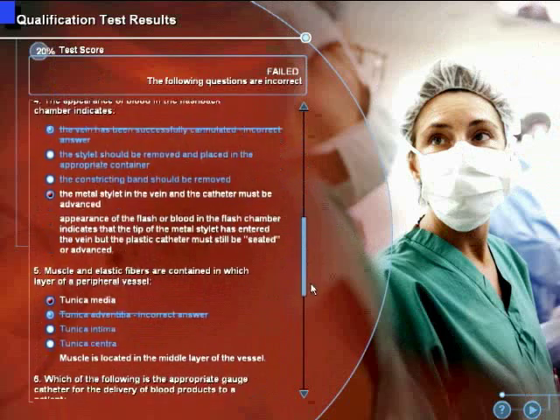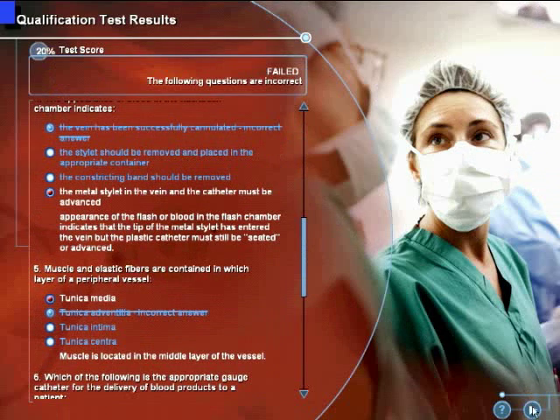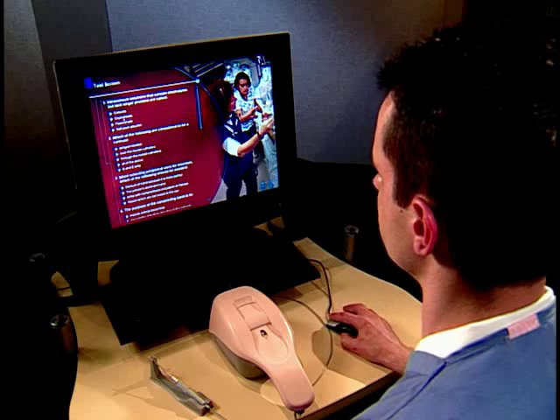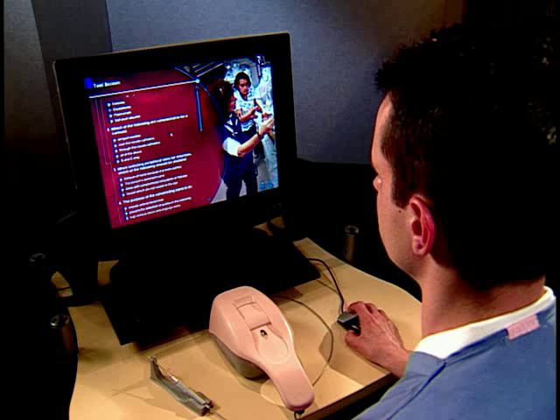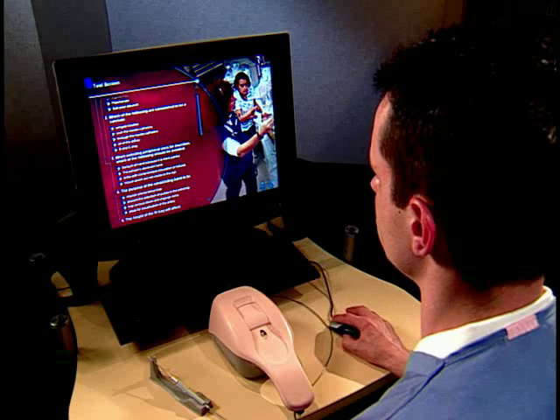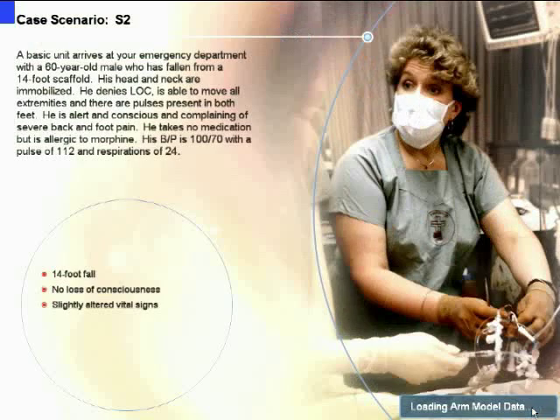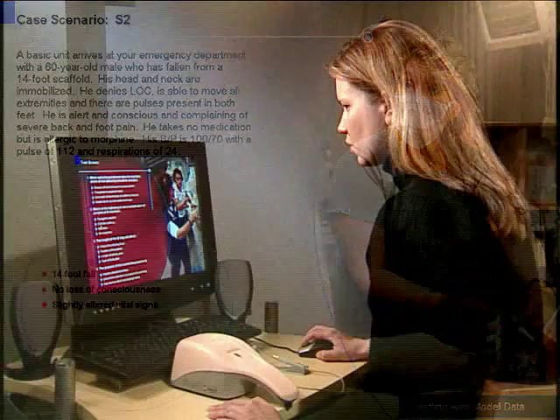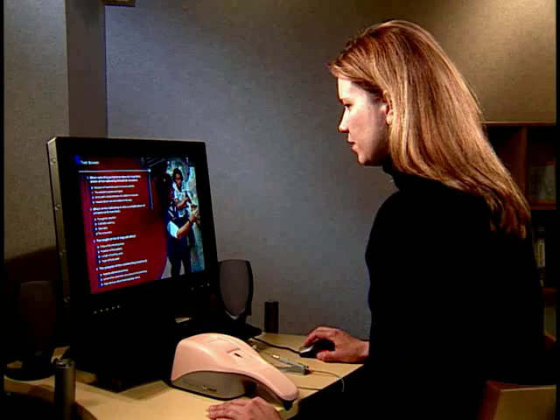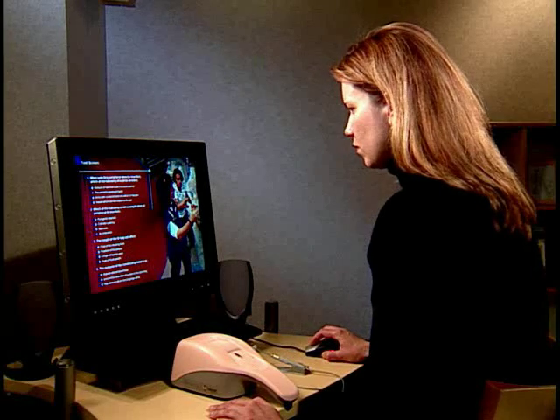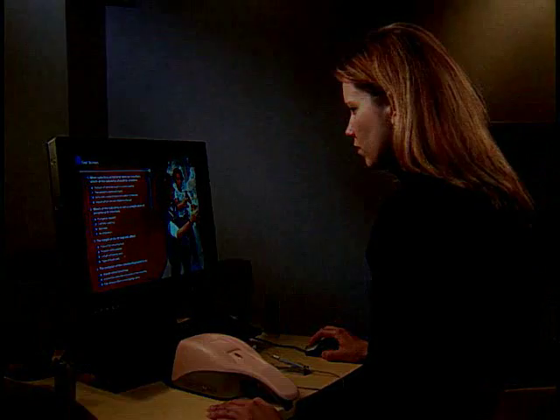The test results screen will show your test score, indicate if you passed or failed, and provide the correct response to incorrect choices. If you do not pass, you will be transitioned to a qualifying test at a lower level of competency. If you pass the qualification test, you will be taken to your first case scenario and begin your career mode training. You will also be required to take cognitive tests to advance to higher levels.